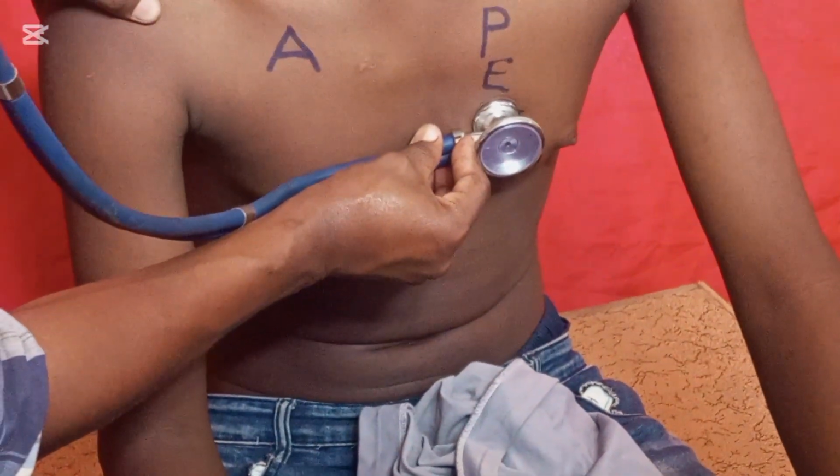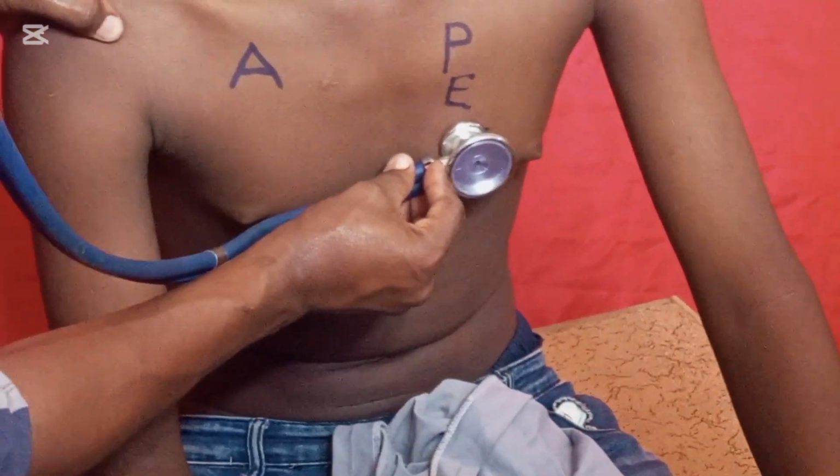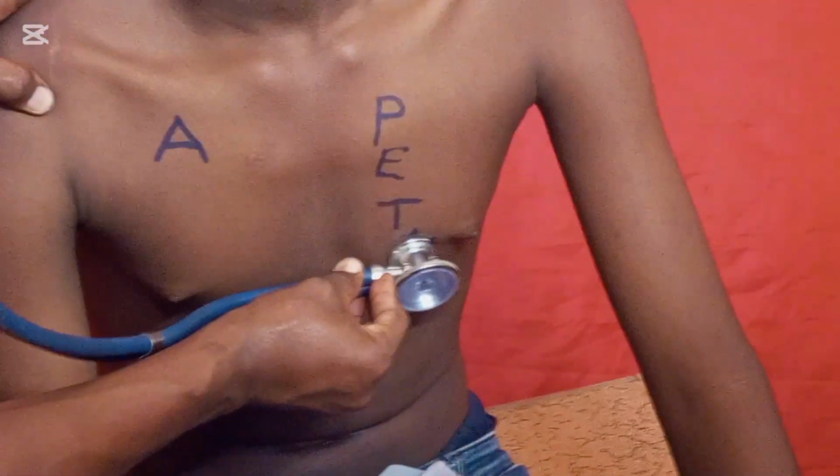Then we move into the fourth intercostal space on the left side of the sternum. Here is where we find the tricuspid valve. Then we move down in line with the clavicle. So this is where we find the mitral valve. So this is how you are going to listen.